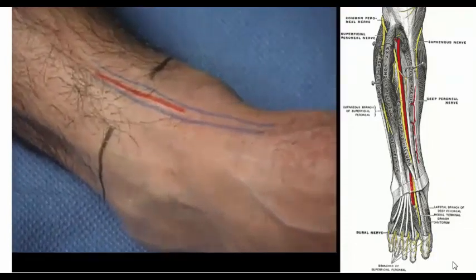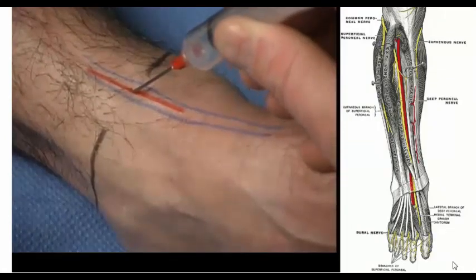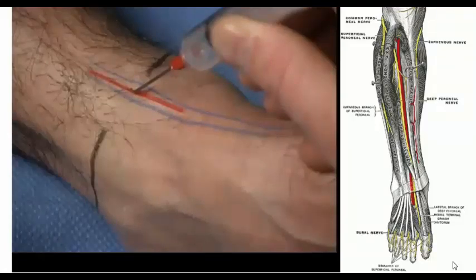Direct the needle between the tendons of the extensor hallucis longus and the tibialis anterior at the level of the superior malleoli. Insert the needle until it is deep to the tendon or bone is struck. If bone is struck, withdraw the needle a few millimeters. Inject approximately 5 milliliters of anesthetic.